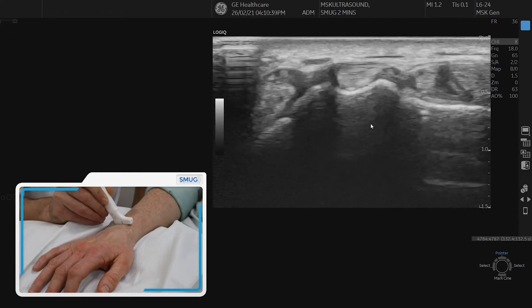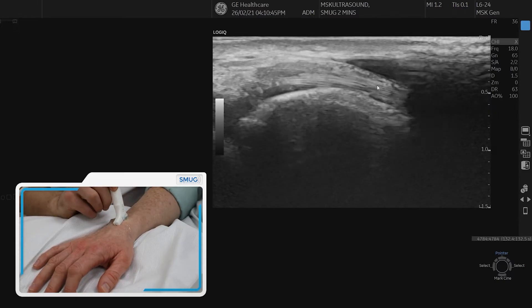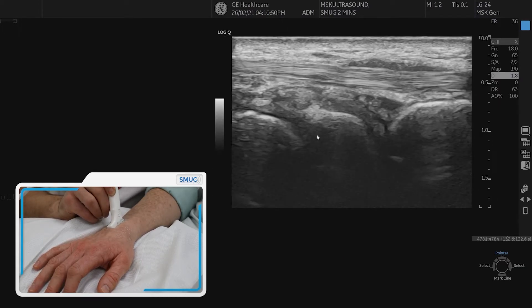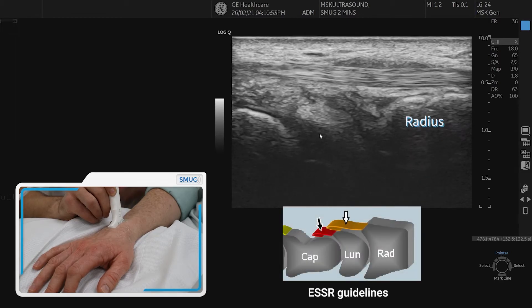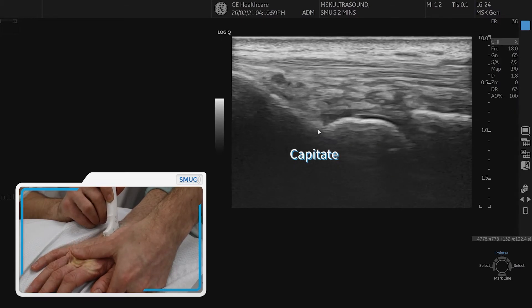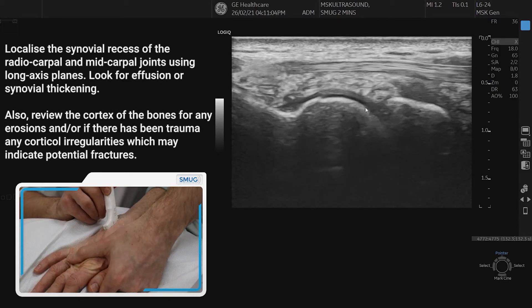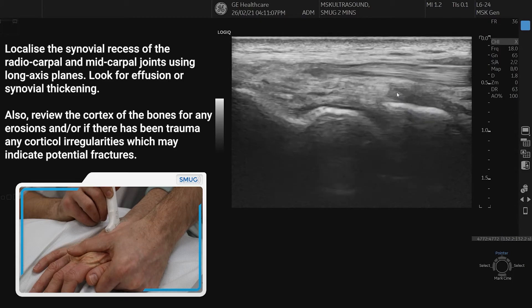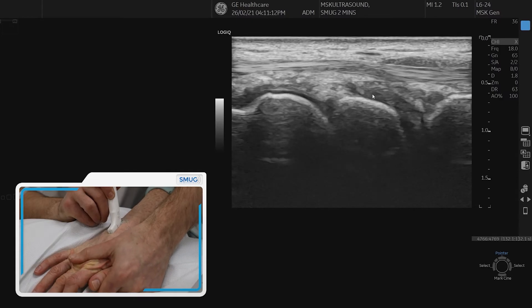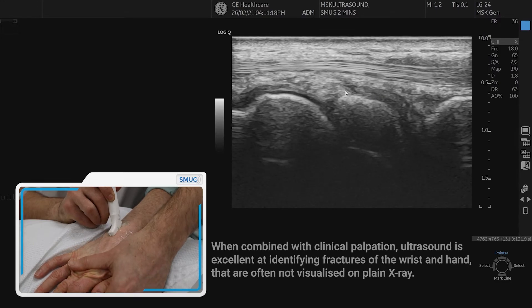Next we go back up to Lister's tubercle and spin on it to get a classic view of the wrist joint: the radius on the right, the lunate bone in the middle, and the capitate bone. We're looking carefully for any synovitis or joint effusions and can individually assess these joints. It's also really important to look out for any erosions, because the wrist can be a region where you get systemic inflammatory problems such as rheumatoid arthritis.